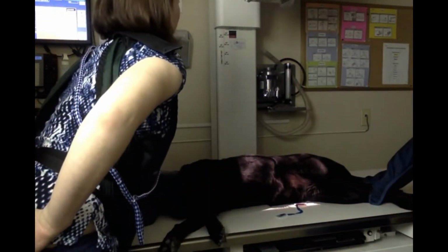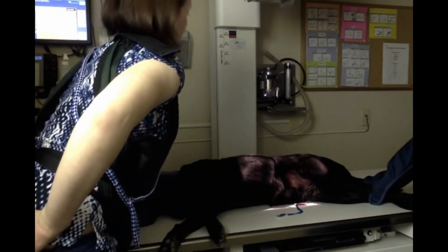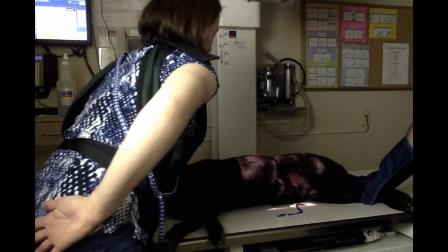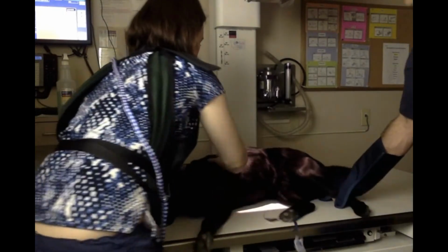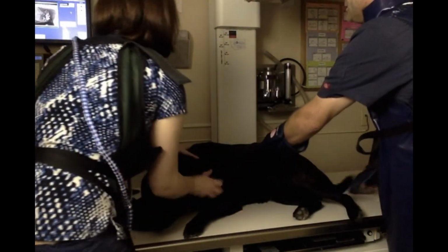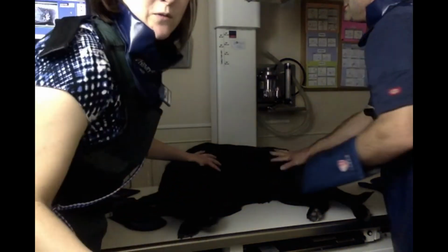So I'm going to go ahead and take this picture. I'm going to do it when she's exhaling. There you go. Oh, Skittles. And luckily, we got that image right before she moved.